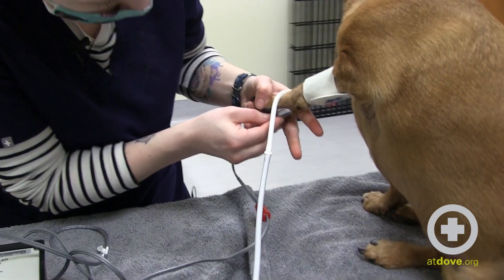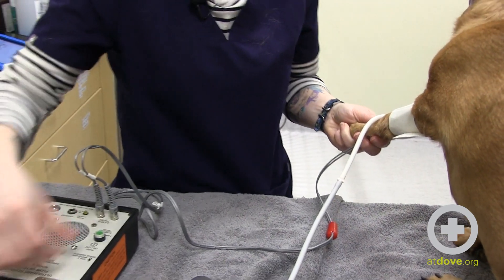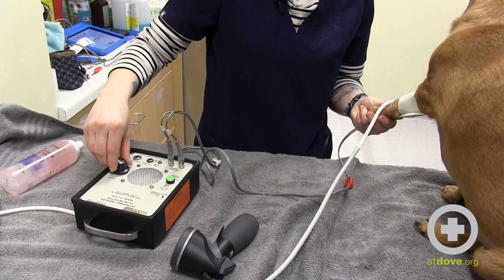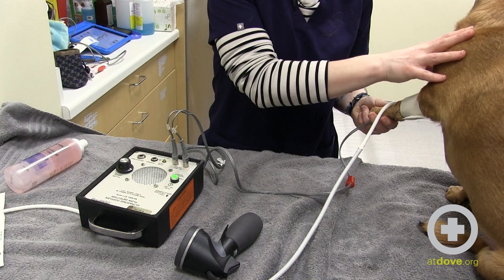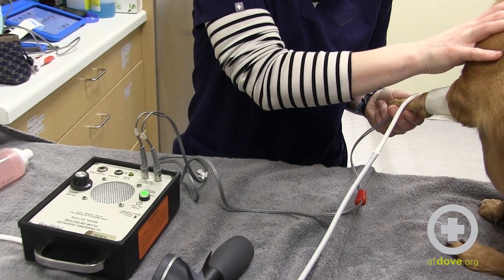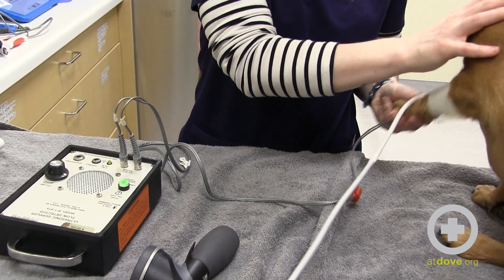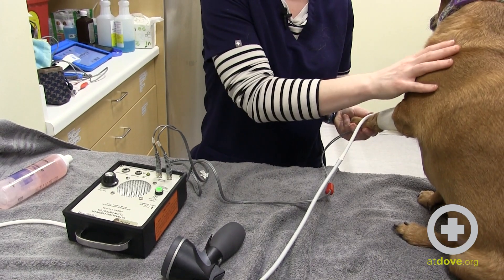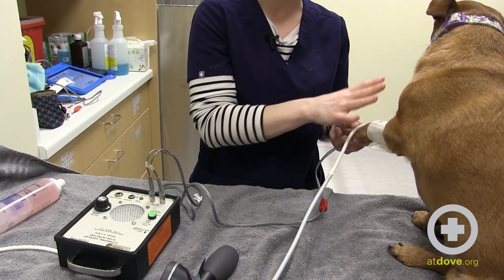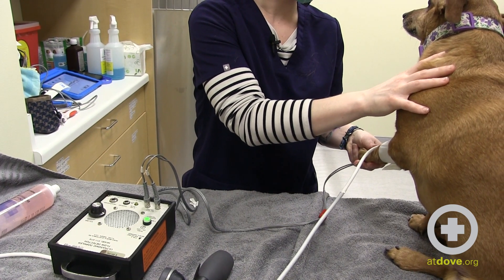I'm going to go ahead and pick up Penny's arm, place the crystal on there, turn the machine on, and turn up the volume. And that's the sound we're looking to hear. As I'm holding her, I'm putting very little pressure on her arm. If I actually press really hard, the sound goes away. This is a really common mistake — people think that the harder you squeeze, you're going to get closer to that vessel and hear it louder. But actually, if you squeeze, you're going to occlude your vessel and not be able to hear it. So if you think you're in the right place, just loosen up a little bit and you might actually be able to find that sound again.